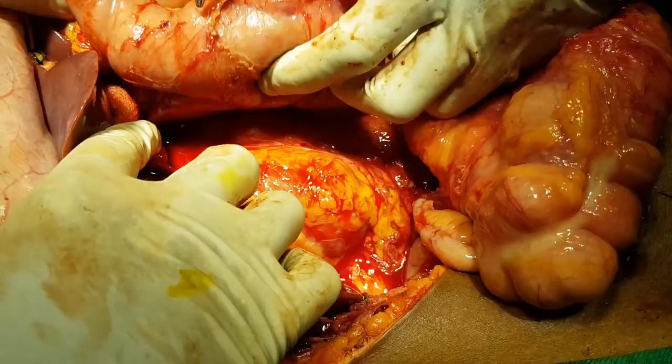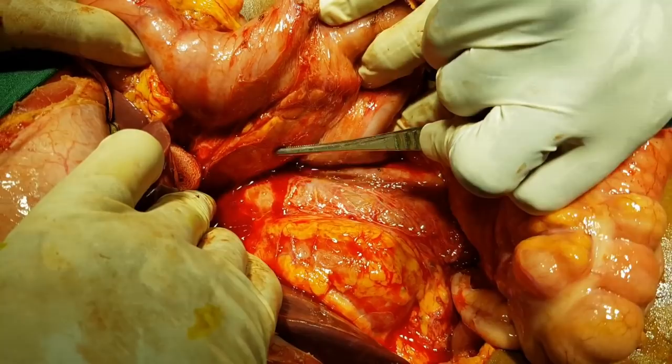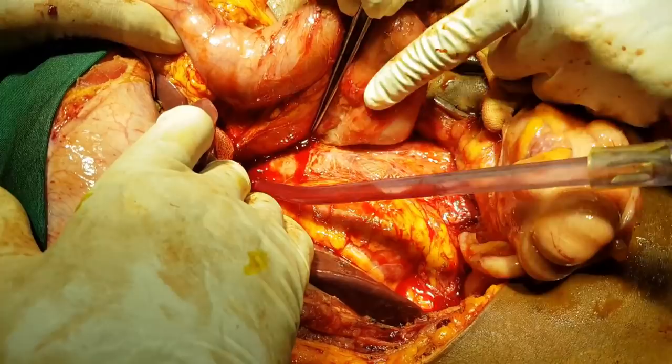Posteriorly, you can see the IVC. The instrument is now touching the IVC, and you can see the posterior part of the pancreas. Following the duodenum third part, you can now see the instrument touching the duodenum third part.